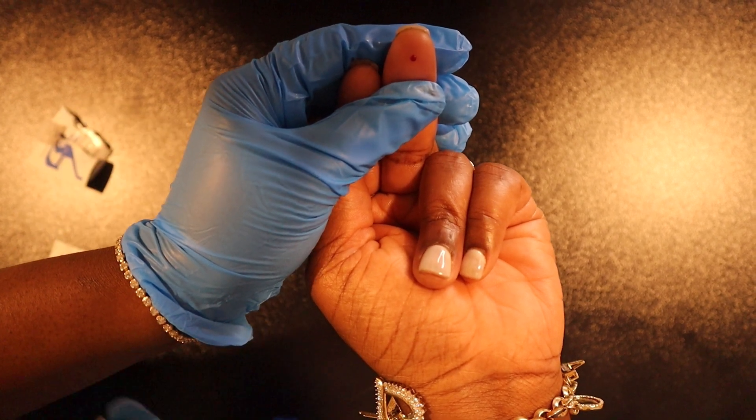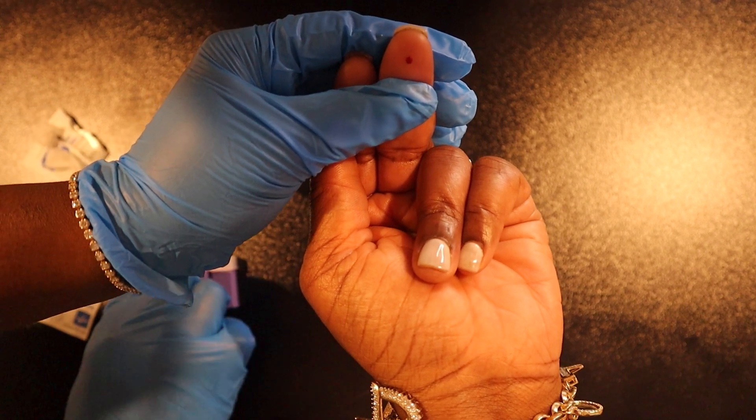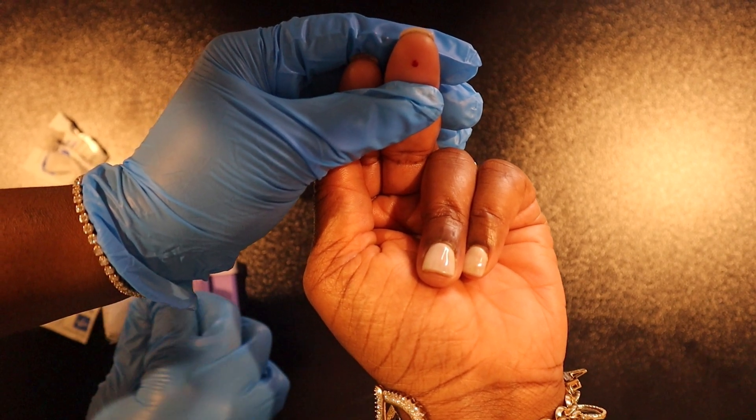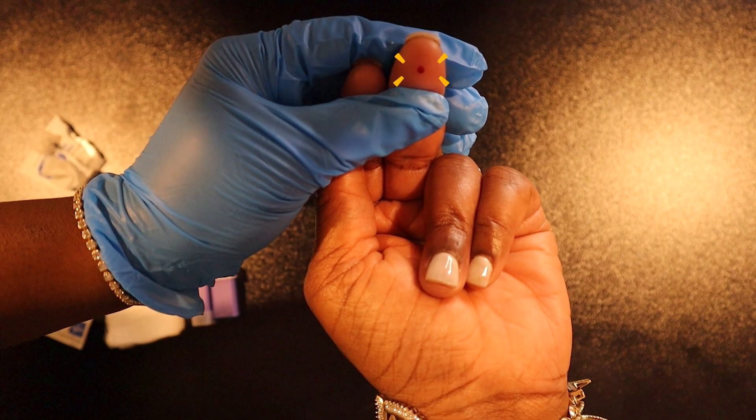I prick the middle so you all can get a good view of what I'm doing. Wherever you prick the finger, just be sure that you are pricking a site that is warm, intact, and free from edema, bruises, or calluses.